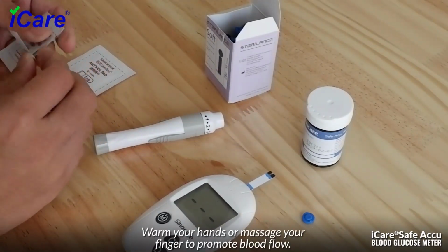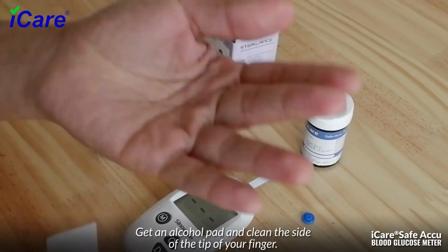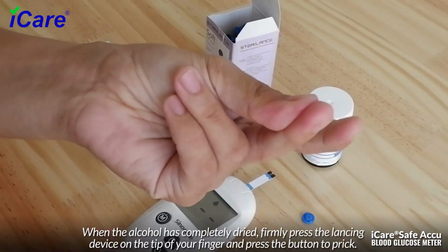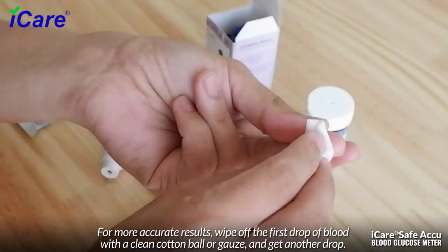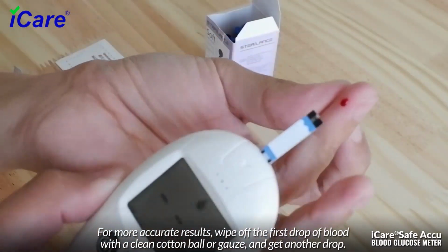Warm your hands or massage your finger to promote blood flow. Get an alcohol pad and clean the side of the tip of your finger. When the alcohol has completely dried, firmly press the lancing device on the tip of your finger and press the button to prick. For more accurate results, wipe off the first drop of blood with a clean cotton ball or gauze, and get another drop.